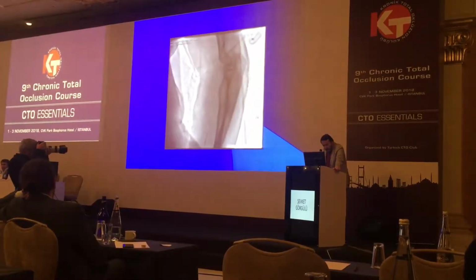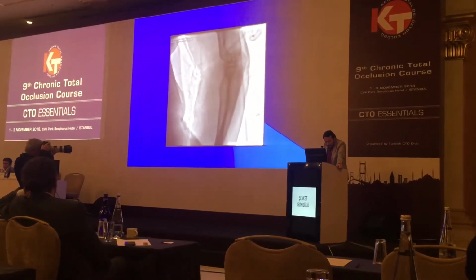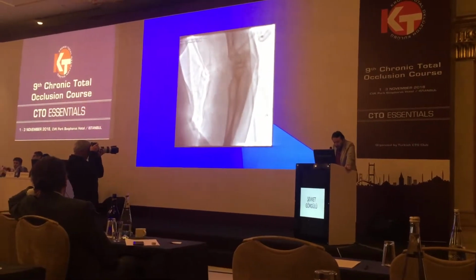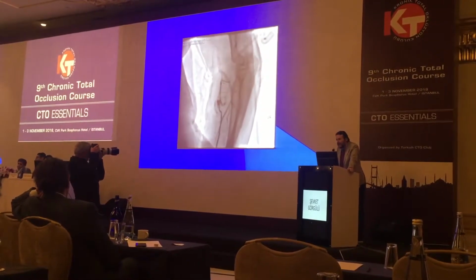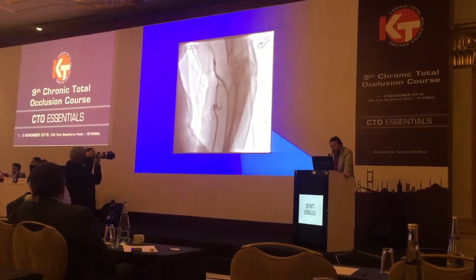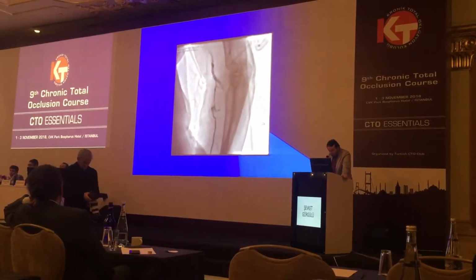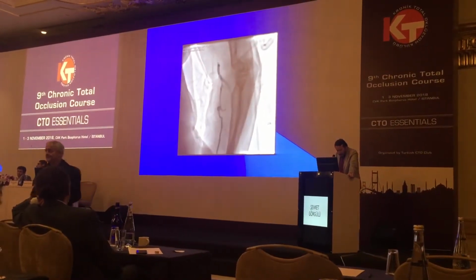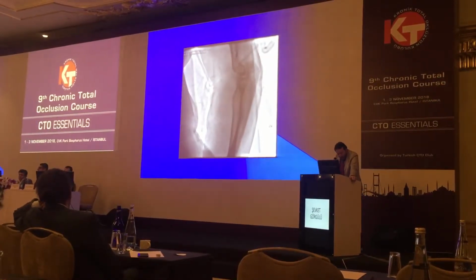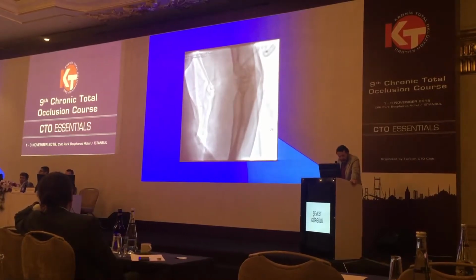The patient was complaining of arm pain since the loop had been smoothened. It was impossible for us to continue the procedure. The left arm was ischemic and cold. I retrieved the guiding catheter, made the sheath bleed, and held the arm in a downward position. The pain alleviated considerably. The radial angiography indicated radial rupture and dissection.